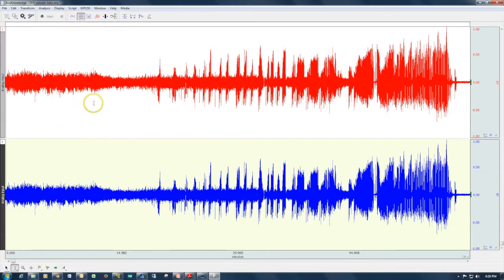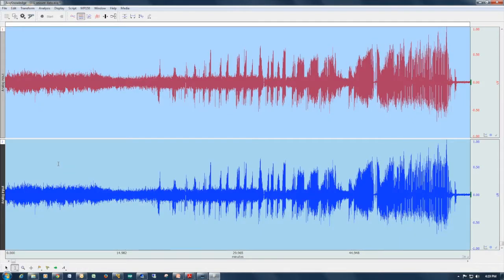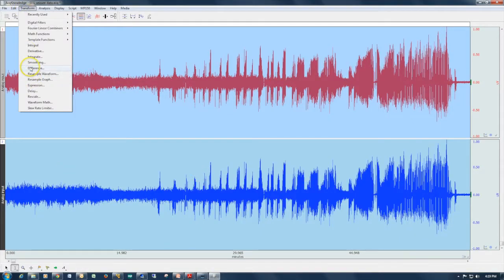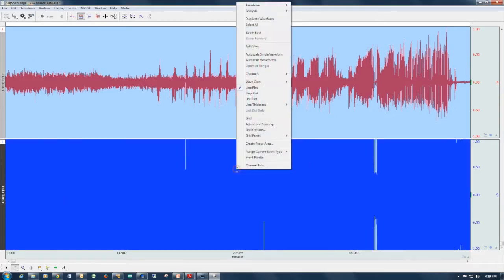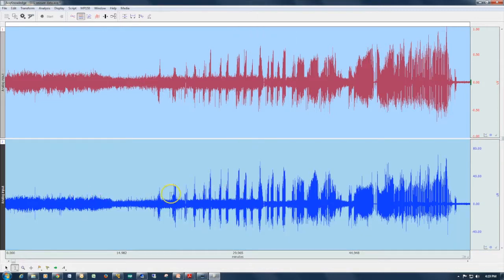The channel was duplicated so that we can run a difference calculation on it. In order to determine where the spikes are — the epileptic seizures — we need to be able to set some rules. So the first thing we do is run a difference using eight samples. Now we have a difference channel, which exaggerates where these episodes are occurring and allows us to set a threshold for identification.